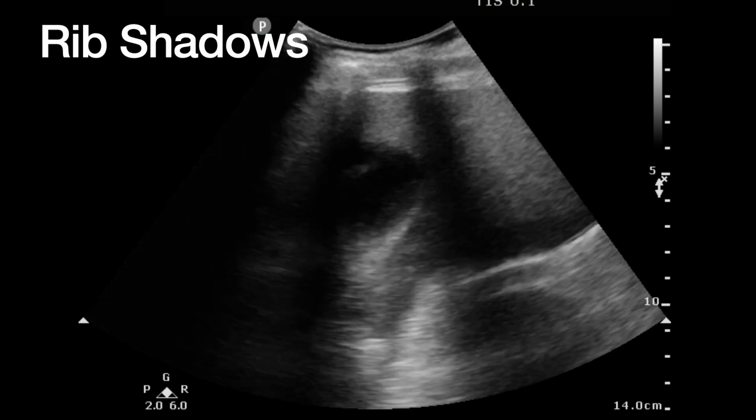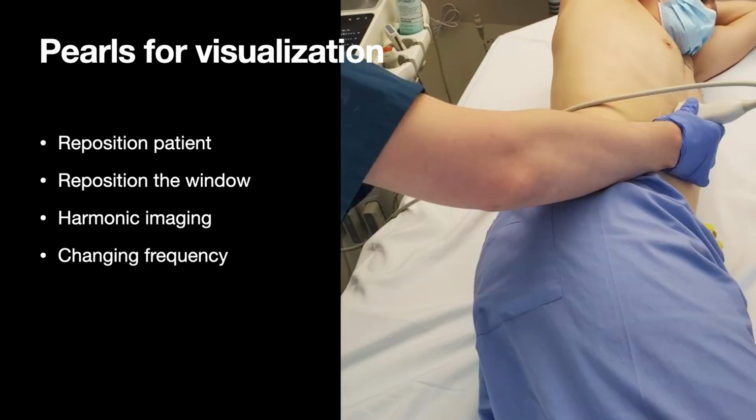The other one that I really, really like is just repositioning the patient, right? And this is one of the things when I go in, patients are always supine on their back. Go in, try to find the gallbladder with the ultrasound, scan through it. If I see what I need, great. I'm good to go. I'm off to the races.